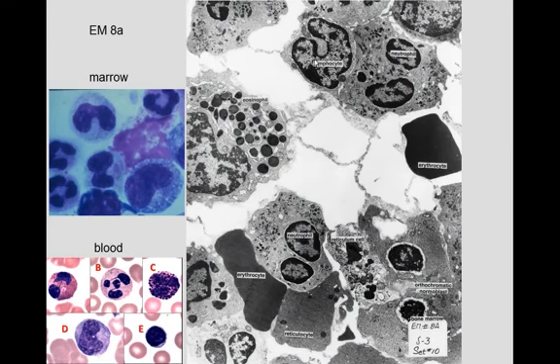So we see some lymphocytes, some erythrocytes, some red blood cells. Also, we see some orthochromatic normoblasts about to pop out some things. Reticulocyte, which is a precursor to the red blood cell, but it's more developed than the normoblast that we see here. Finally, you get the red blood cell. But also here you see a neutrophil developing.